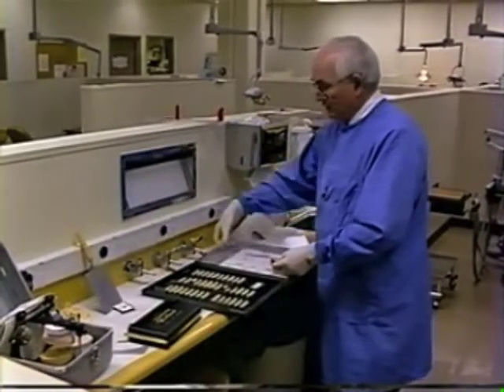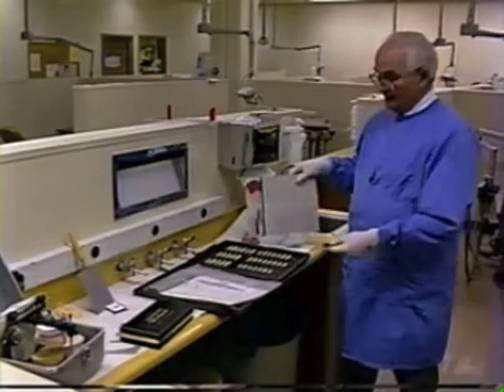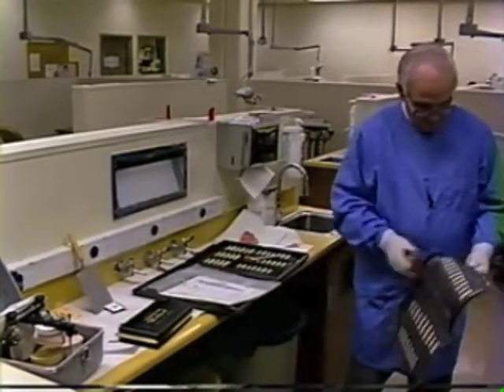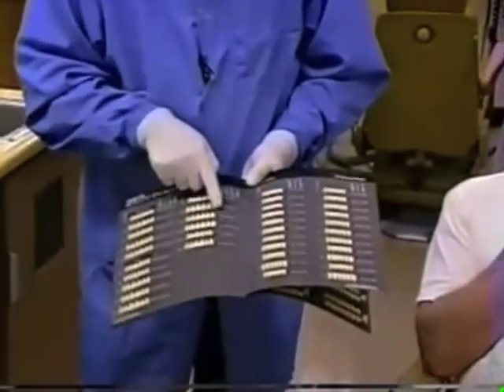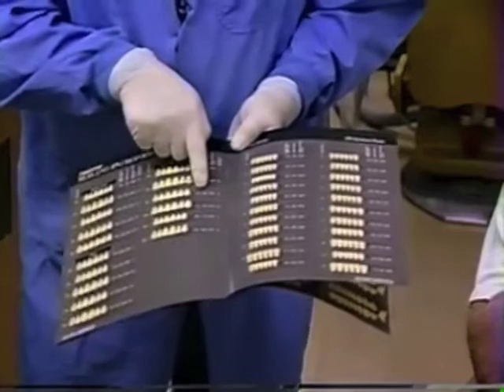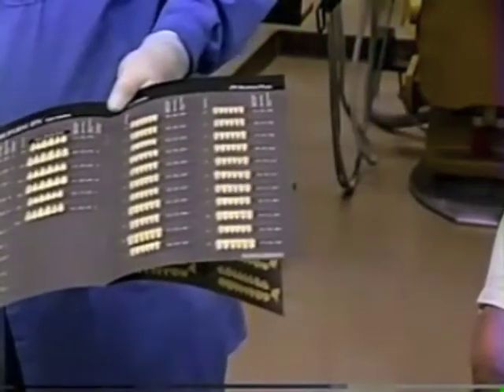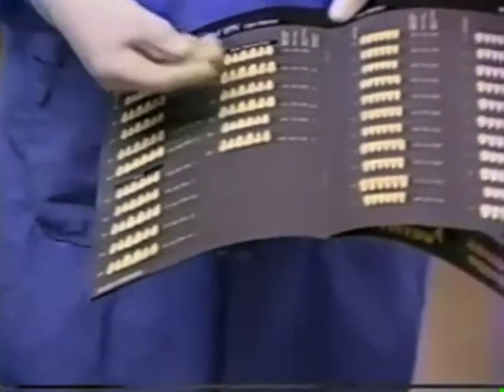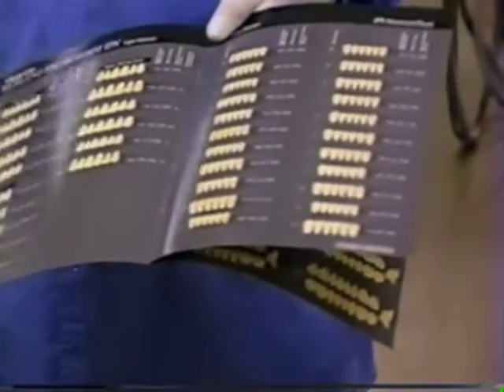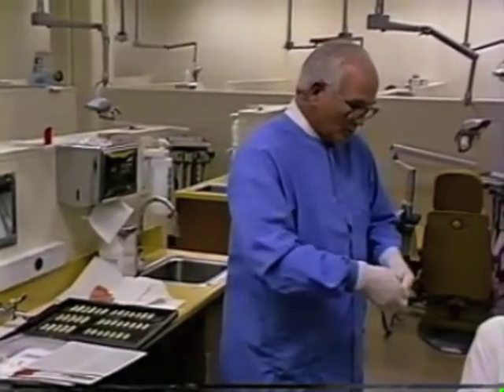One other mold I find very useful, particularly in the square and square tapering range, is the square tapering ovoid tooth. That series is this group — there's a couple of molds that go very well. One is 75E, which is not far from the perfect dimensions we'd be looking for. Another is A84, which has a curl to the laterals — it makes a beautiful arrangement particularly for a feminine setup. I'm going to try the 75E mold, which is sort of an almost universal mold we use a lot, and see if we like it better than 22E, our original selection.